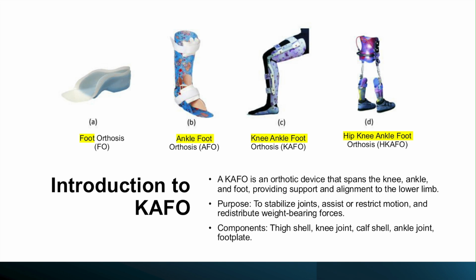because people with muscular problems usually need to use more of their energy to walk, and it can even help in correcting or preventing deformities. Imagine a patient with post-polio syndrome, you can Google what is post-polio syndrome, who cannot stabilize the knee. This device can help them to achieve a more natural and safe gait.